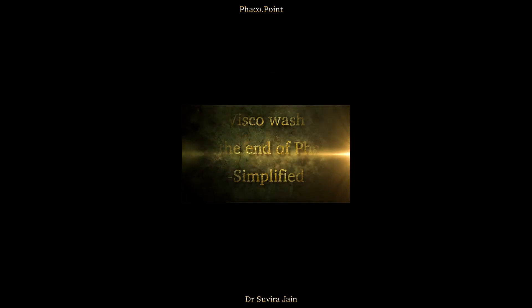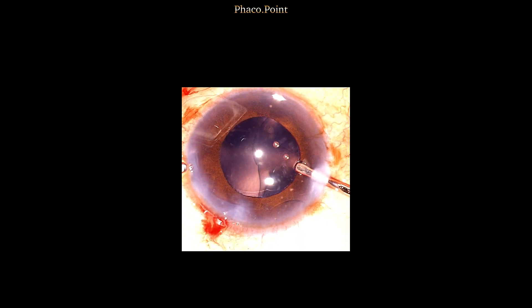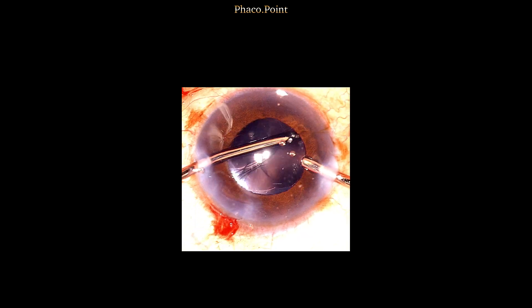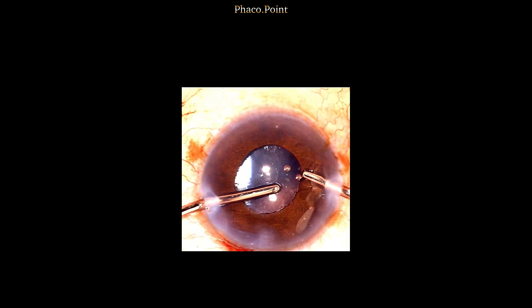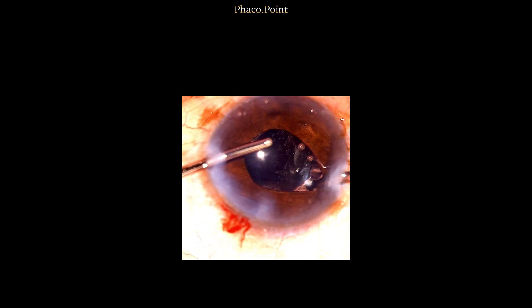Here's the ideal technique of removal of viscoelastic from the anterior chamber and behind the lens after FACO. The irrigation is introduced into the eye with my right non-dominant hand. With my dominant left hand, I take the aspiration cannula and perform a rock and roll movement where I rock the optic to and fro with a view of removing some viscoelastic from behind the lens.